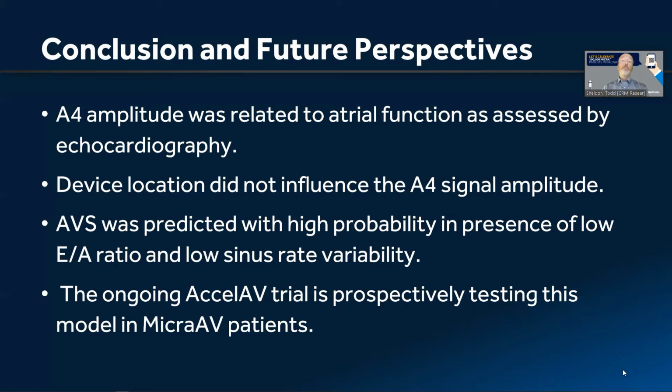We are committed to continuing to do this study. We have the AV trial, which is looking at chronic AV synchrony. That study is ongoing, and we're well on our way there. We have a couple other, bigger studies: a post-approval study that's going on in Europe and in the United States. And then there's also another study that's a condition of approval for United States Medicare that we're doing for the Micra AV. So we're continuing to study this, and so far we've been really happy with the results. With that, I will send it back to the moderator.